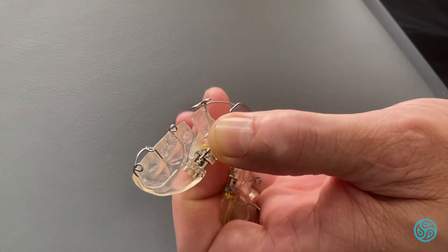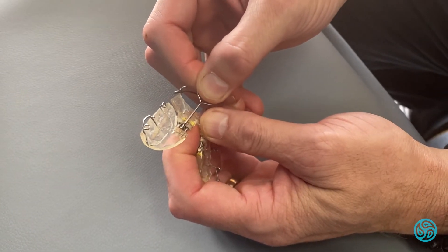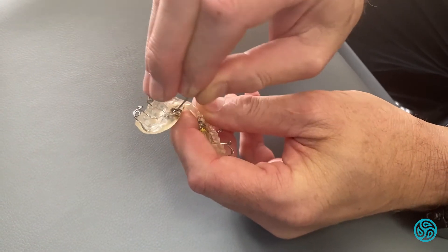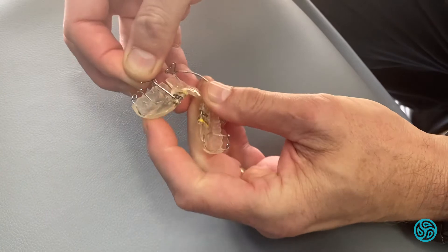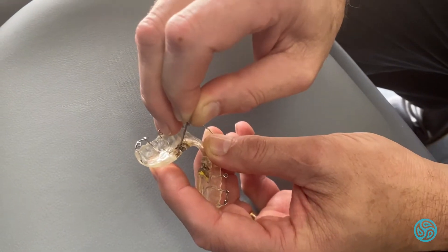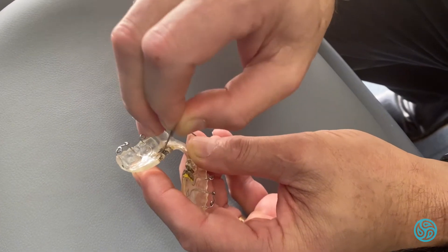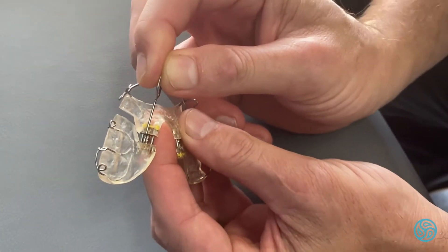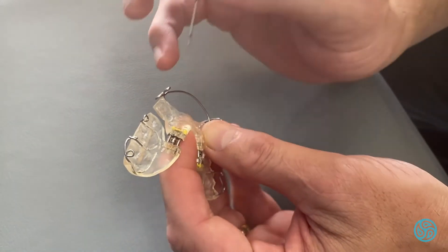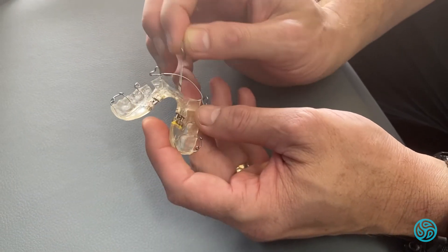That's how I would like it to progress forward until we say stop. If I do these four turns — one, two, three, four — we should be a whole millimeter further along, as that shows. But that happens over time in the two weeks, so don't turn all four together.